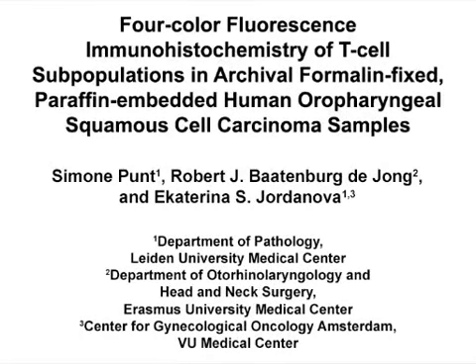The overall goal of this experiment is to perform multicolor immunohistochemical visualization and enumeration of various T lymphocyte subpopulations in archival formalin-fixed paraffin-embedded tissue sections from oropharyngeal squamous cell carcinoma samples. This method can help answer key questions in the immuno-oncology field, such as: is there a link between tumor tissue infiltrating immune cell subpopulations and patient prognosis?